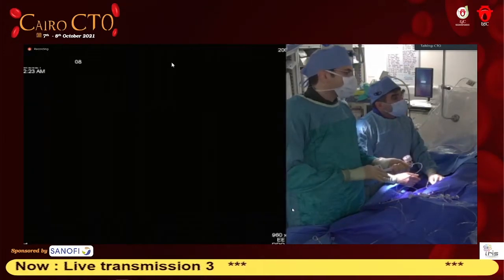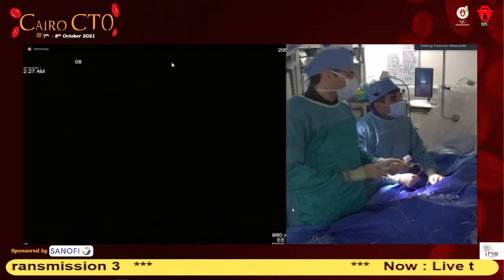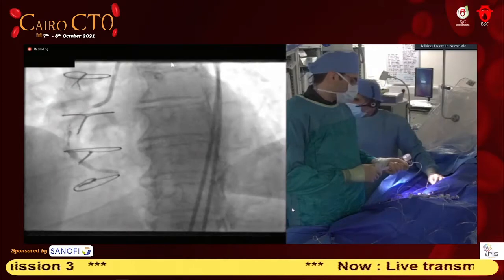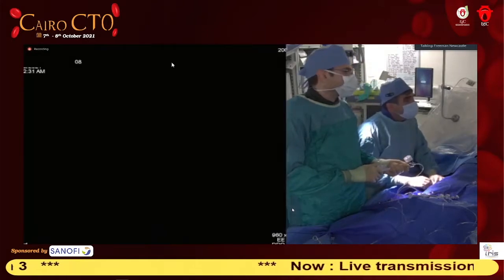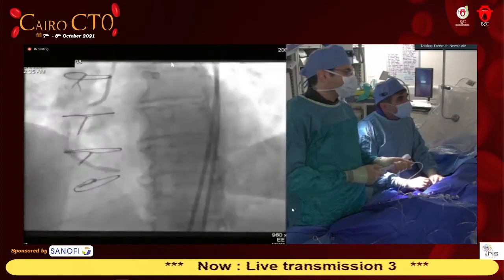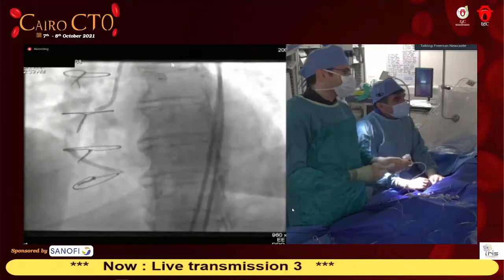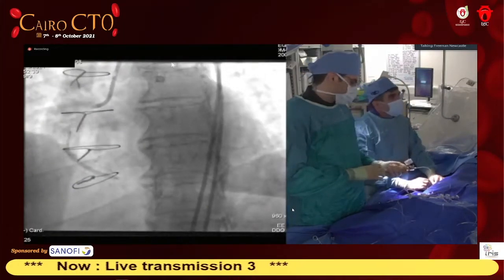Yeah, this is very tight. Yes, this is why it's underfilled distally. In fact, I should make it a 4.0. Make it a 4.0, 38. Well, we have an area which we saw in the IVUS still, but we'll sort it out. Okay, 10. Open now. Expanded now. 12. And down.